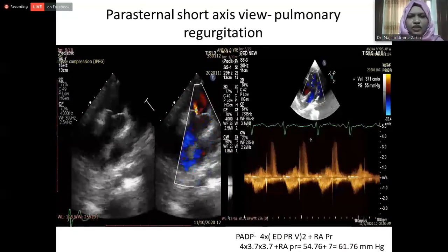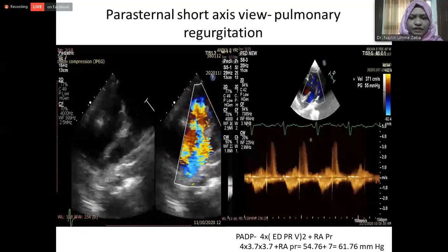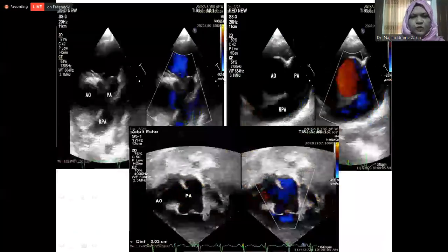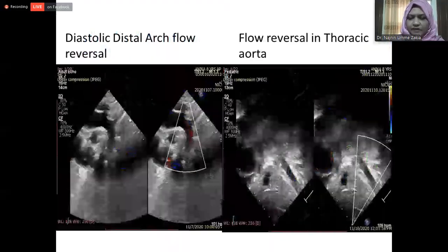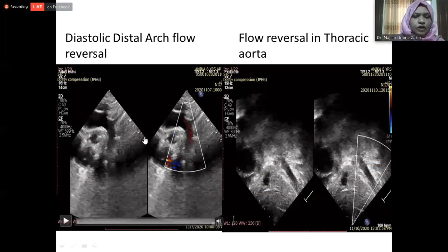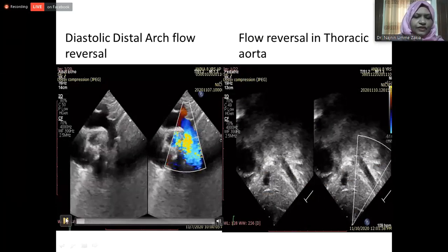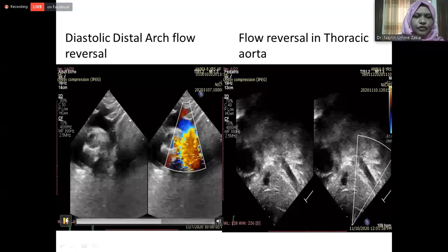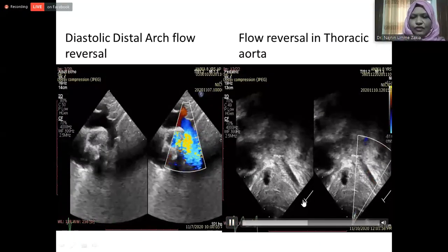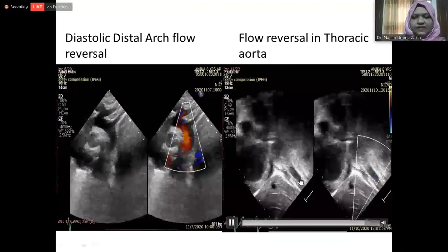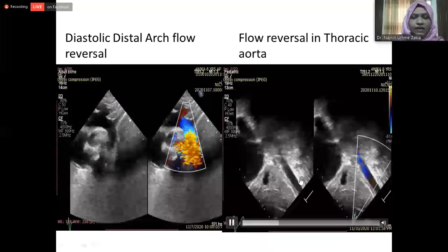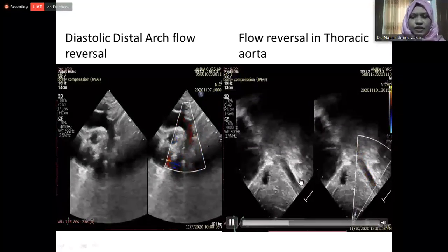We can measure the pulmonary systolic pressure from the tricuspid regurgitation jet velocity using the Bernoulli equation. This parasternal short axis view shows significant pulmonary regurgitation, and from the pulmonary regurgitation we can measure the pulmonary artery diastolic pressure from the end-diastolic jet velocity. This is the suprasternal long axis view showing — with color flow interrogation — retrograde flow during diastole. This is diastolic flow reversal.